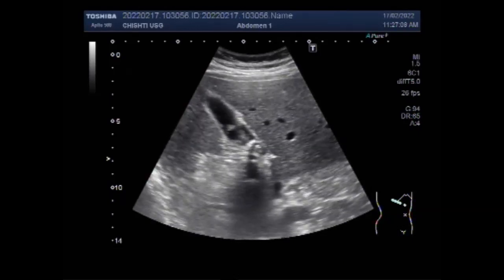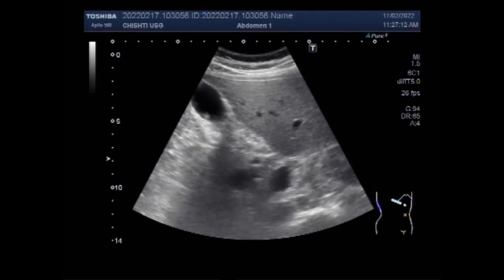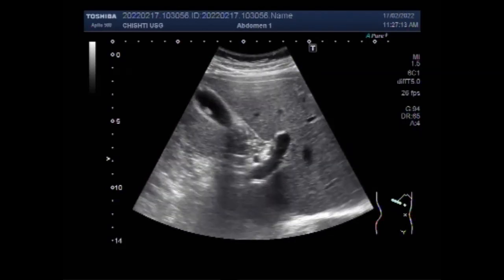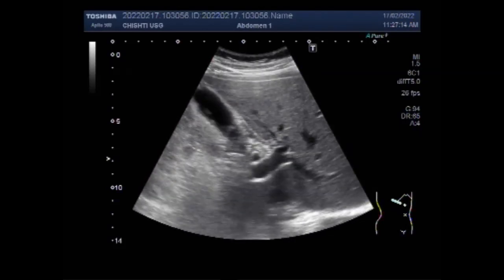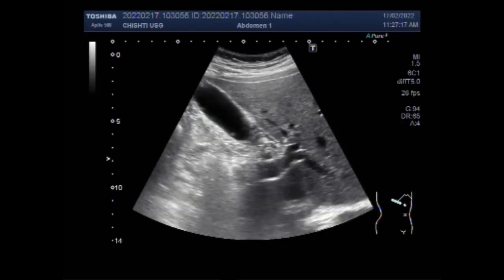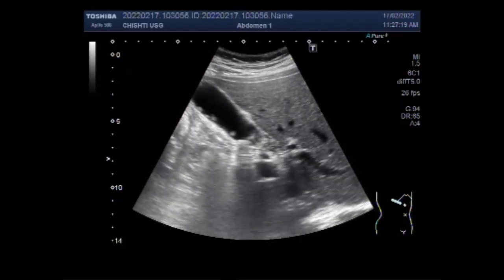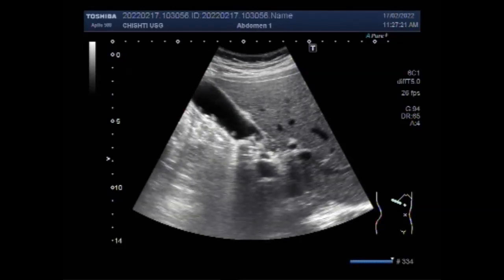Again, you can see the stones as well as the gallbladder polyps. Now the causes of gallbladder stones: gallstones may form if the bile contains too much cholesterol, too much bilirubin, or not enough bile salts.